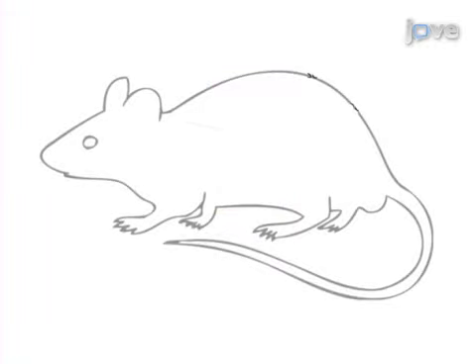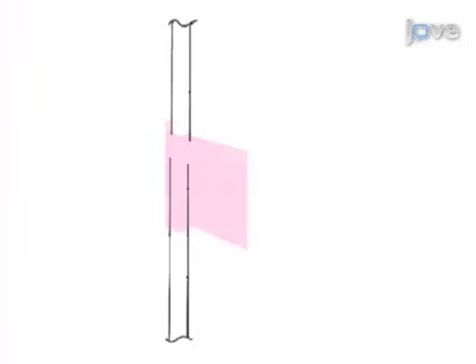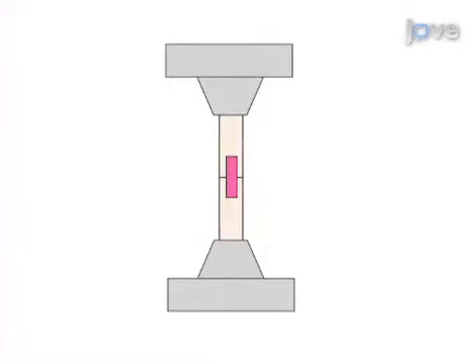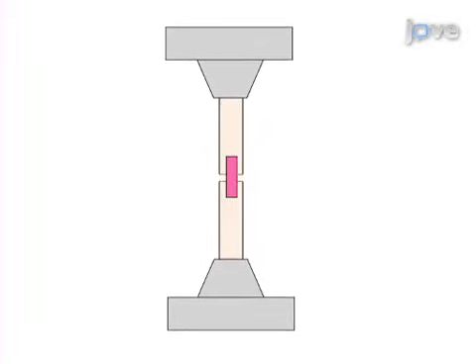The third step is to expose the rat nerve and dissect it. The final step is to place the film around the dissected nerve and irradiate it with a green laser to bond the film to the tissue. Ultimately, the strength with which the rose film bonds to the tissue is measured using a calibrated tensiometer.